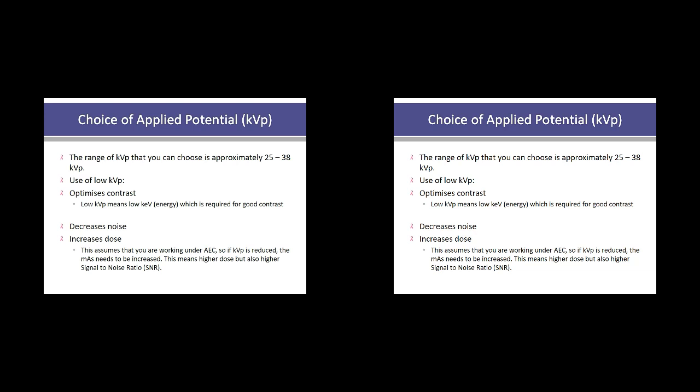If we go with low kVp, what we want to achieve at the image receptor, i.e. the detector, is a certain number of X-ray photons to get adequate signal-to-noise ratio within the image. So often the trade-off is that if we increase kVp, we can decrease mAs, and that helps us achieve a reasonably low dose to the patient. In mammography, the fact that we're using low kVp and the fact that we need very low noise in the image does mean that we give a reasonably high mAs. For the average size breast, we'd probably be giving about 100 mAs.